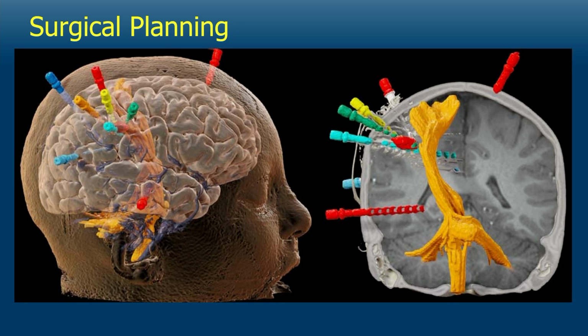This type of data is really helpful for the surgeons and for our epileptologists when they're reviewing the EEG data to determine exactly where to resect, how big the resection should be. And what is more cool is that we can transfer all this data, not just from the software package, and move all these images and the post-processed images into the operating room itself. The surgeon can use it almost like a GPS or roadmap to help them when they are doing the surgery.